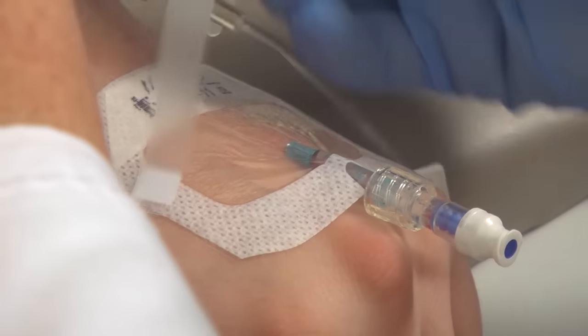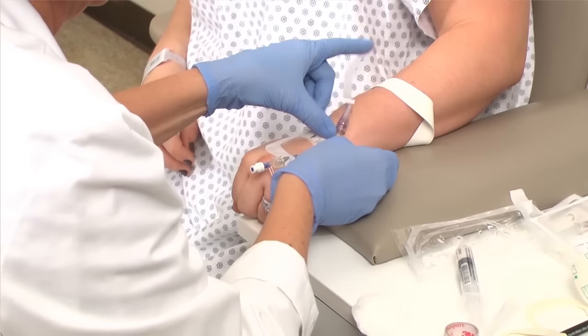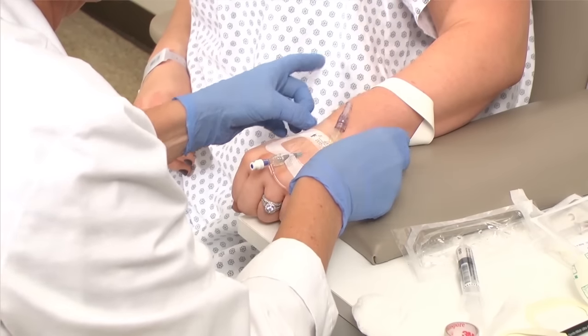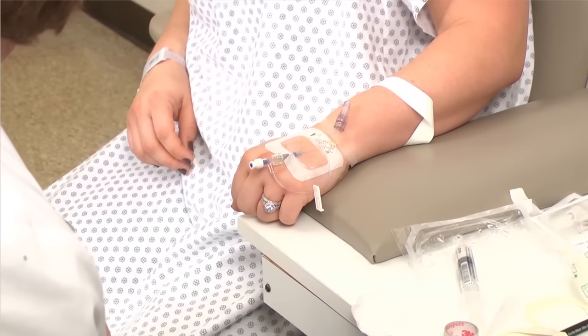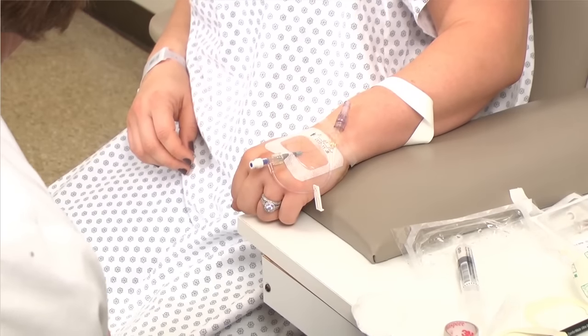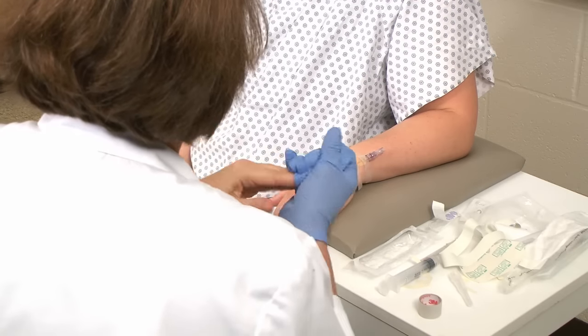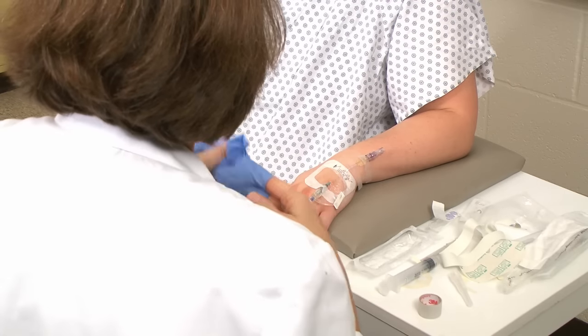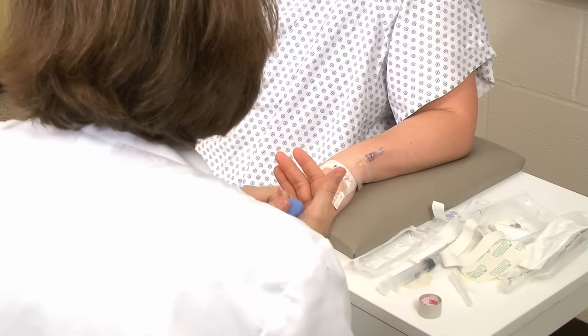Secure with tape as needed. Thank you — you did a great job! Thanks, it didn't hurt at all. Alright, I'm going to clean up my supplies, get rid of my sharps, wash my hands, and document. I'll be right back with your fluids.